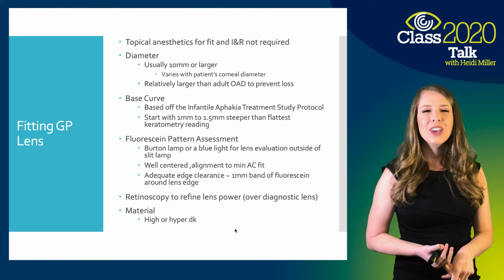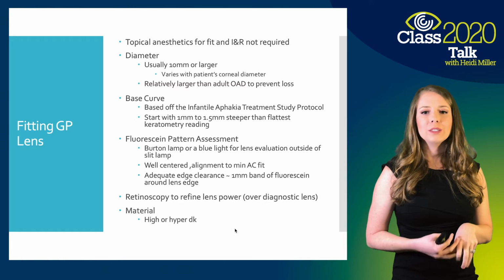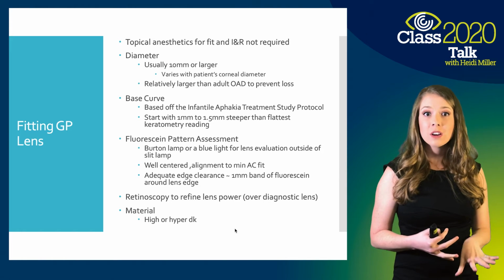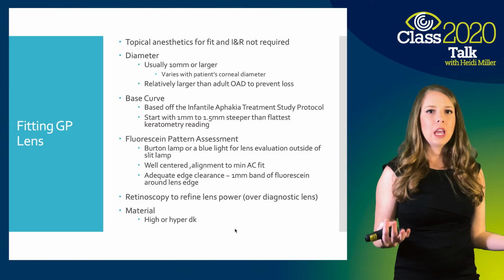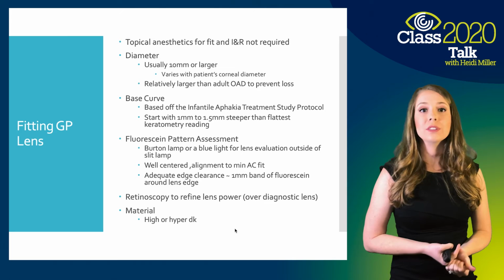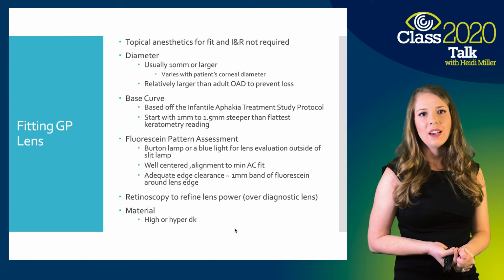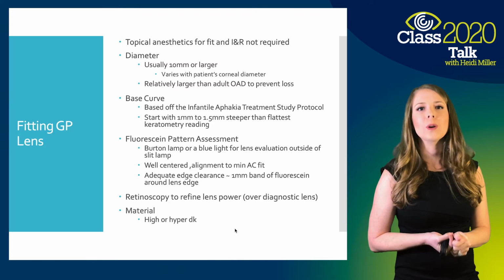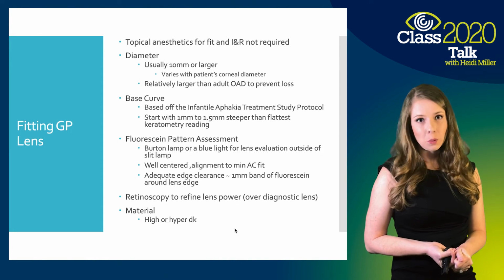Usually patients are crying or they're fussy because of the fear of the experience with the contact lens itself, fear of the unknown. They're a baby, someone's touching their eye. They've already gone through a lot of different surgeries. So it's usually that that's making the patient uncomfortable or crying or having fear, and not really the lens awareness.